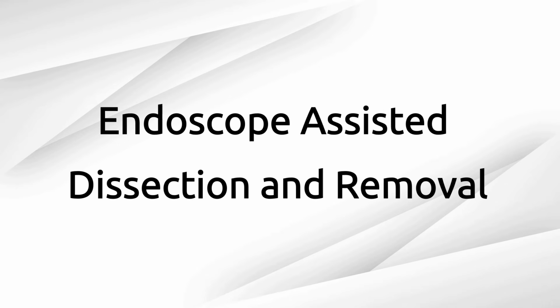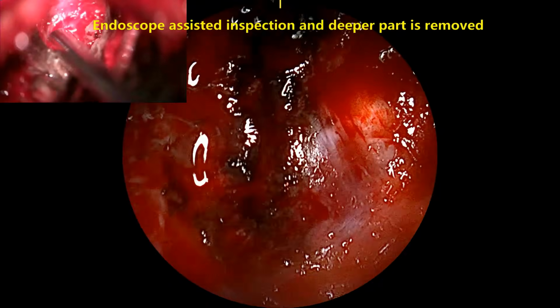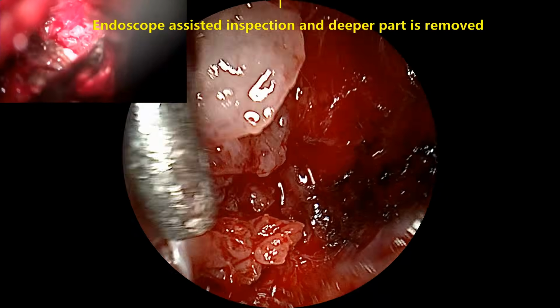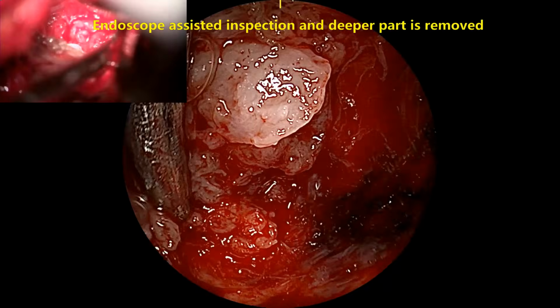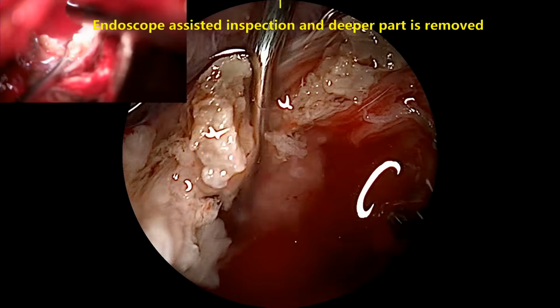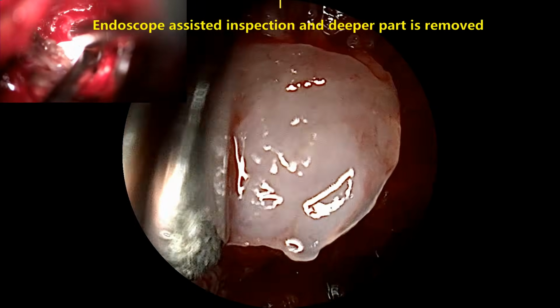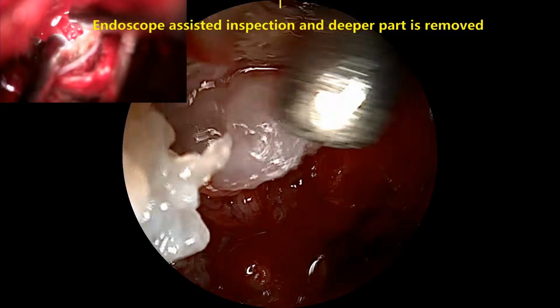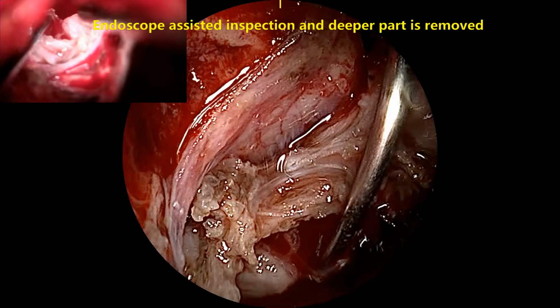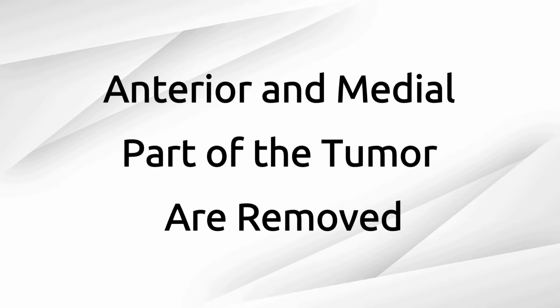So at this juncture, we bring in the endoscope and visualize the extent of resection, that is into the deeper part, posterior and superior part, which is not being visualized with the microscope. With the help of the endoscope, the part of the tumor which is not visualized in the deeper aspects, medially and superiorly, is dissected and removed.